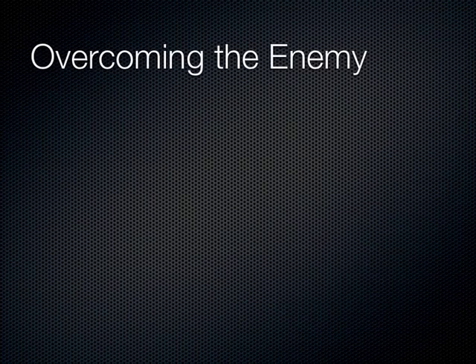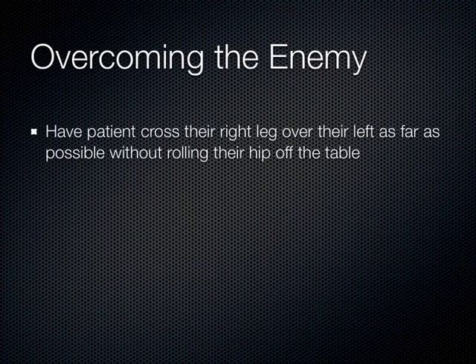So how do we overcome that enemy of bowel gas? Well, the first thing I do is have the patient cross their right leg over their left leg, and we'll do this today with the models.